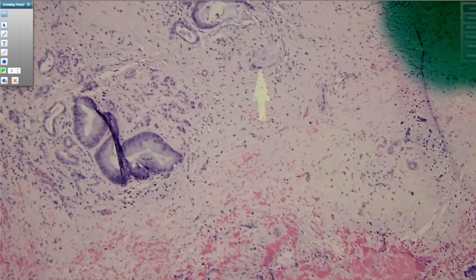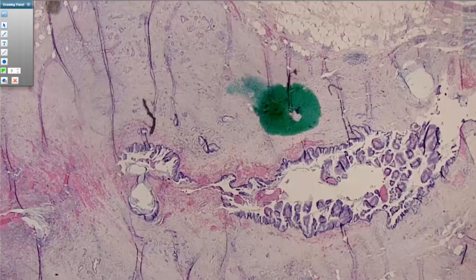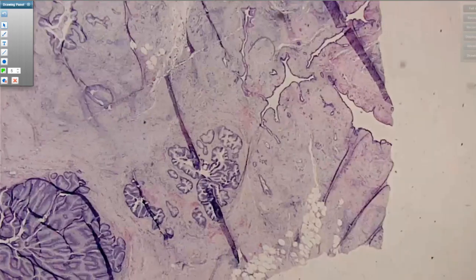Like, what is that little guy? The stroma here looks a little more concerning. But when you look at what's next door, you have this little lobule of chronic pancreatitis with these small atrophic ductules, incompletely involved by this neoplastic epithelium. So this could easily be in keeping with another little lobule that just has some rupture associated with it. So again, while it's very suspicious, not for me diagnostic, and again, might be an area that you consider cutting down and seeing if it develops into something more definitive.